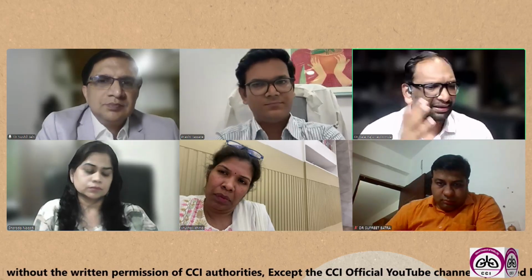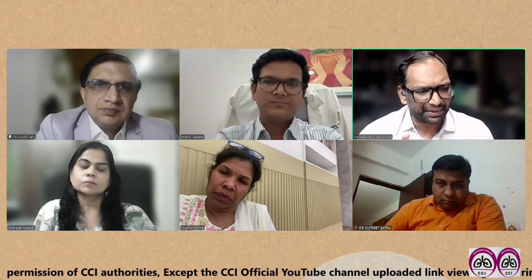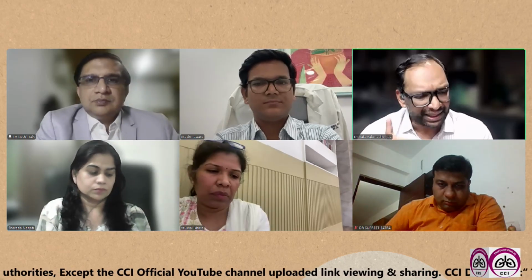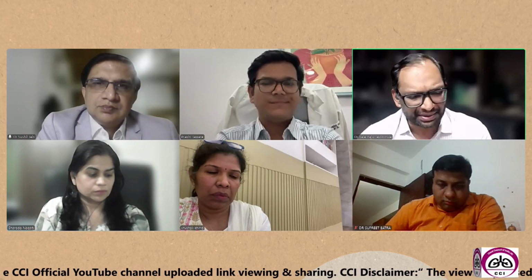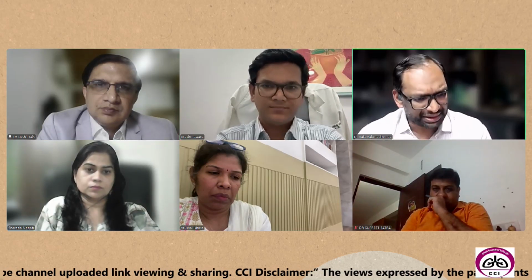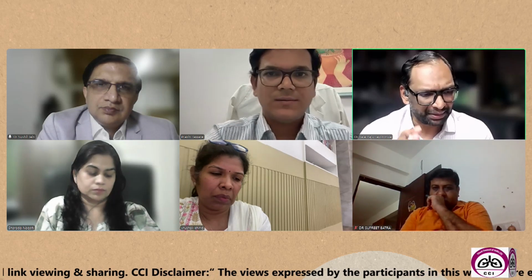And the second point is, I only do general anesthesia in high-risk patients, especially if you have obesity. That's what really matters. If you have a thick neck, large face, obese patient, you have to do an EBUS, and these are tricky patients, which you will not be able to do under deep sedation. Also, in cases of SVC syndrome, these cases are not easy to do under deep sedation. Or if you're doing a small lymph node, especially, this point has been touched, when you are doing a small lymph node and you want to do a good technique.